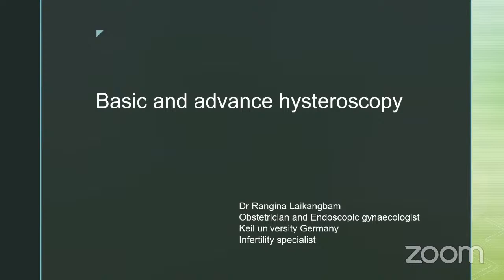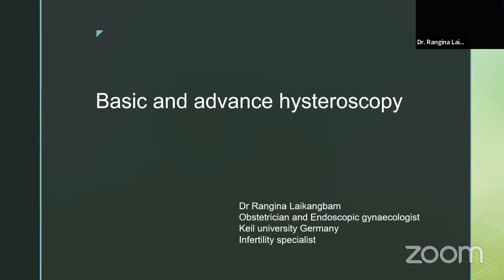Yes, ma'am. The first question is, is DNC, that is dilation and curettage, the same as hysteroscopy? No, it is not the same. DNC is a blind procedure. We use the curette: we put in a speculum, hold the cervix with a single tooth vulsellum, insert the curette, and scrape the endometrial tissue from the anterior, posterior, and lateral walls.